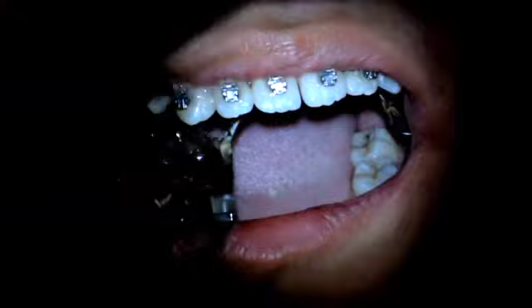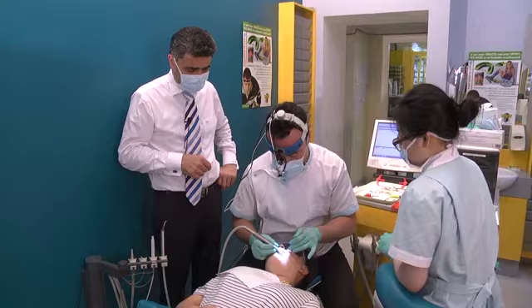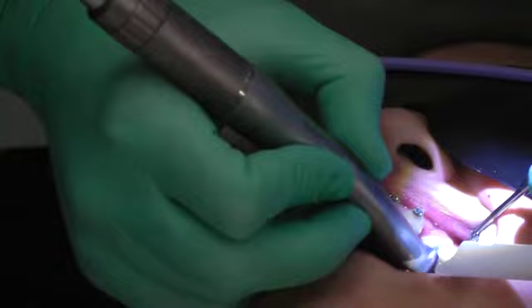Some suction now. So that's the expander out. Now we're removing the remaining cement using the multi-fluted tungsten carbide burr in the reduction head handpiece — what we call the double red band handpiece.